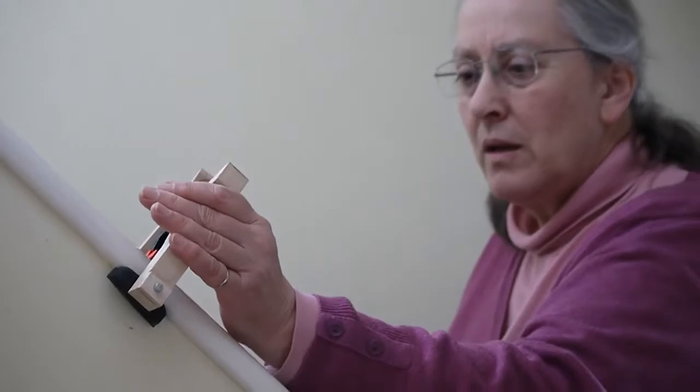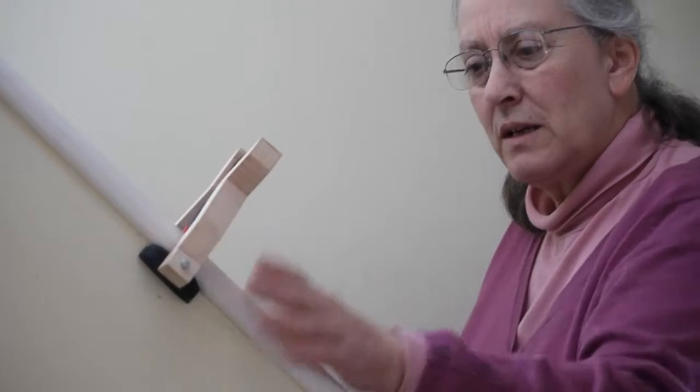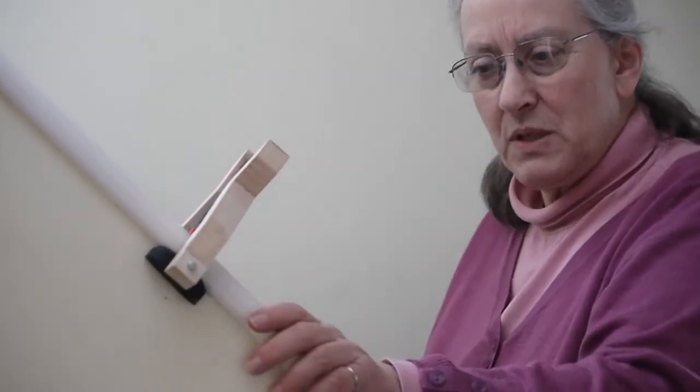It's okay. It doesn't feel particularly sturdy as if it would take too much weight, but the clamp bit seems to be quite secure.